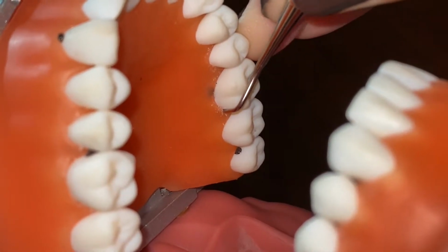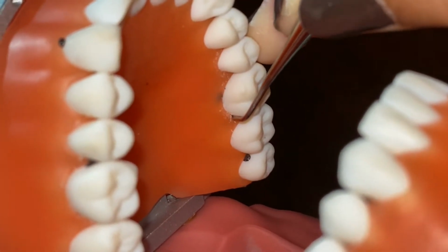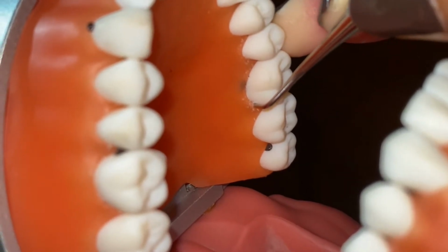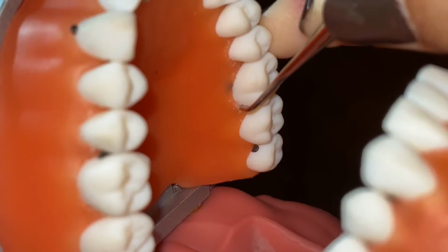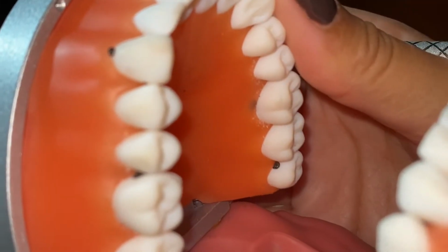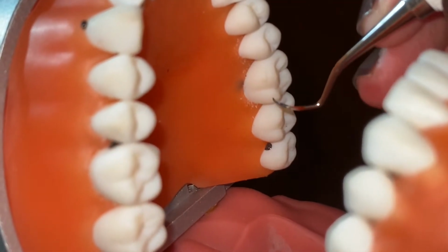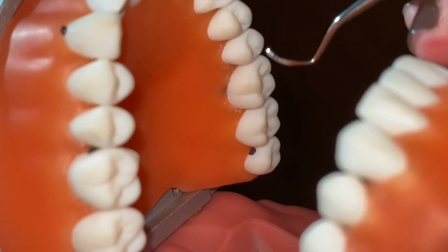Getting into the interproximal, you'll pivot in there. Down, down, down. Remove your blade. And then flip the blade around, starting at that distal lingual line angle, and then we're going to make our way towards the mesial.